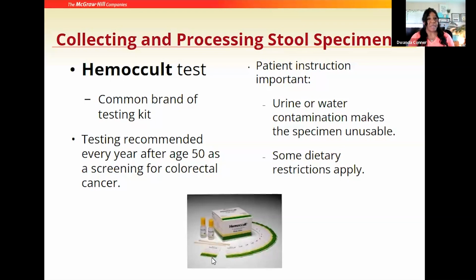So once that smear is placed on the card on one side, then we flip the card over on the other side, apply the solution, and then it will give you either a color telling you that it's positive or negative, or it will actually read a plus or a negative for a positive or negative reading.